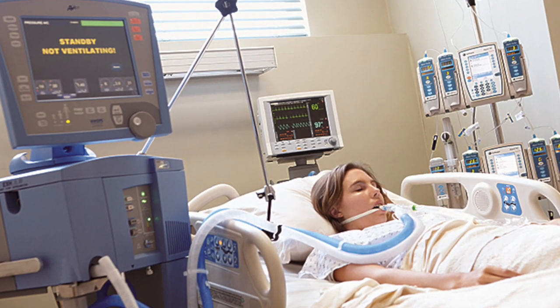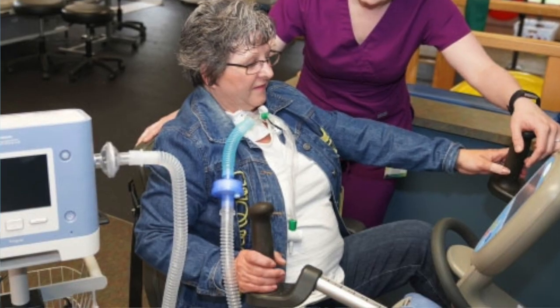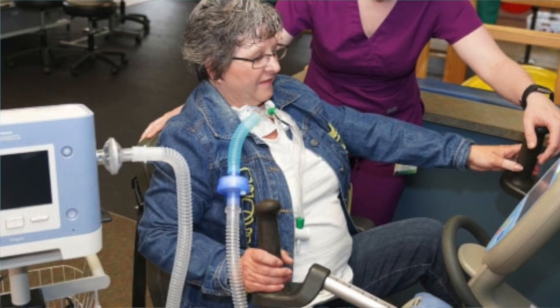Mechanical ventilators are commonly used to treat patients who require respiratory support or who are experiencing respiratory failure. They may also be used long-term for the management of a chronic medical condition. The ventilator takes over the work of breathing for the patient when he's not able to breathe or if he's not able to breathe adequately on his own.